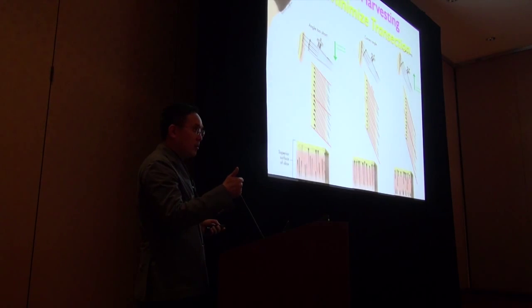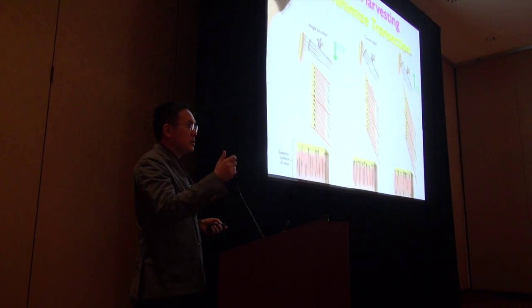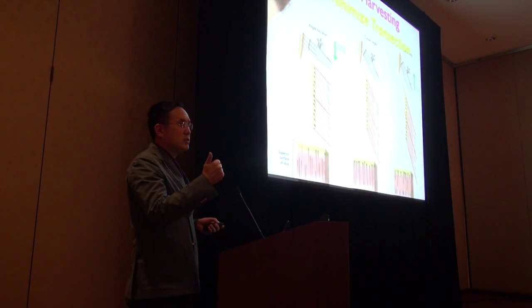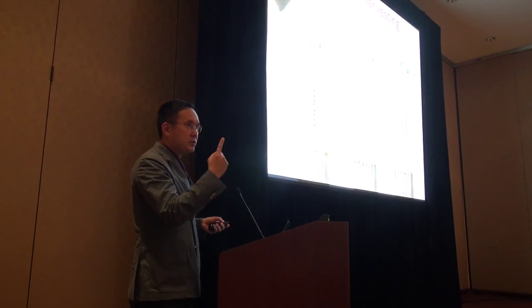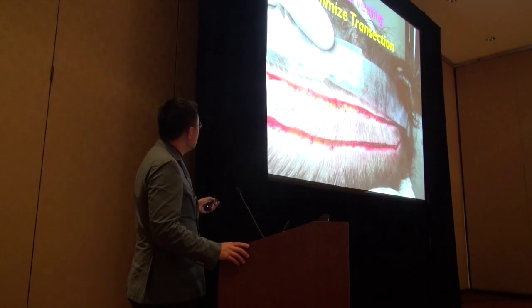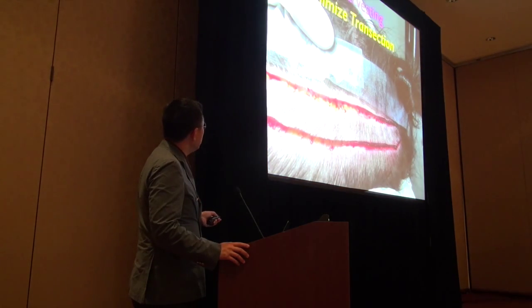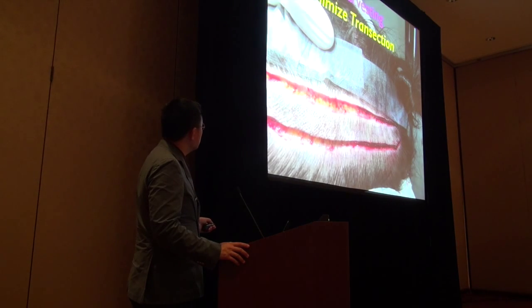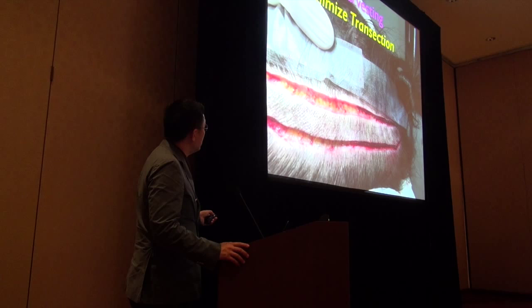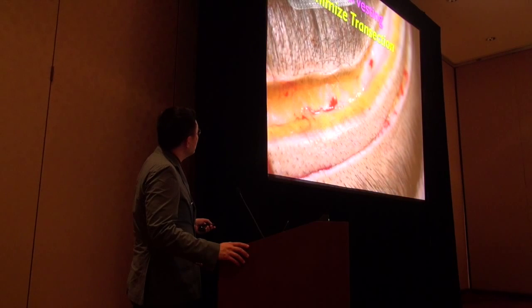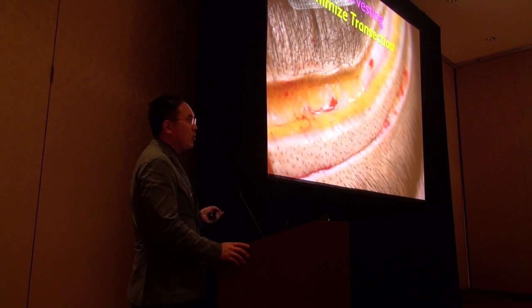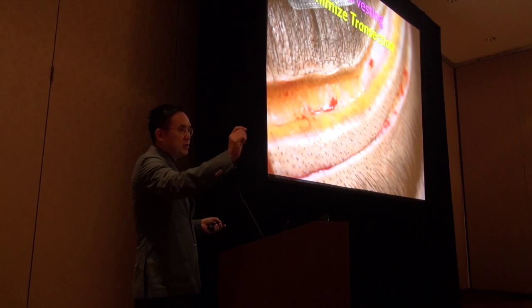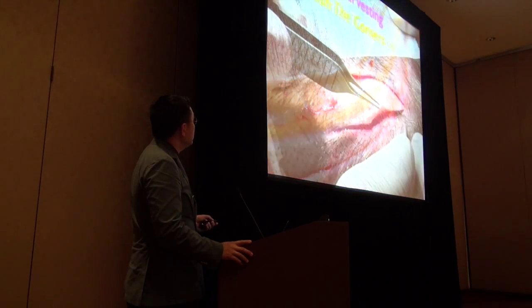Minimizing transection minimizes scarring in the back. The reason for bad donor scarring, besides taking too much out, is poor harvesting — not whether you're a good surgeon who closes well. Anyone can close the wound; it's harvesting that leads to good wounds. You can see this is a typical wound with very little bleeding and very clean sites. You don't want to go so deep you're touching the galea — just past the bottom hair bulb. It should be minimal transection, a very clean and bloodless plane. I maybe once a year use my cautery device — you shouldn't be bovie-ing this area.